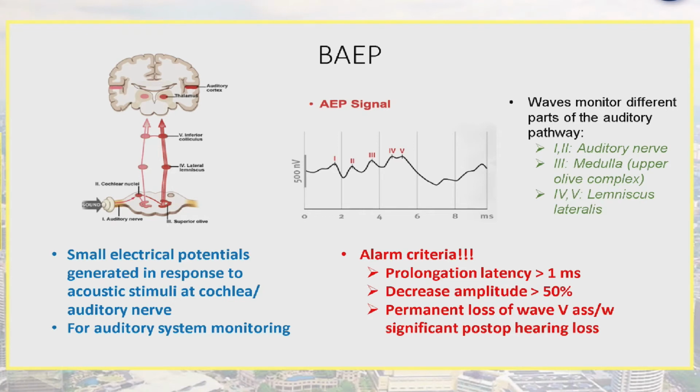So the alarm criteria, we must be alert and see the shape: prolonged latency of more than 1 millisecond, decreased amplitude, and if there is a permanent loss of wave V, there will be significant postoperative hearing loss.